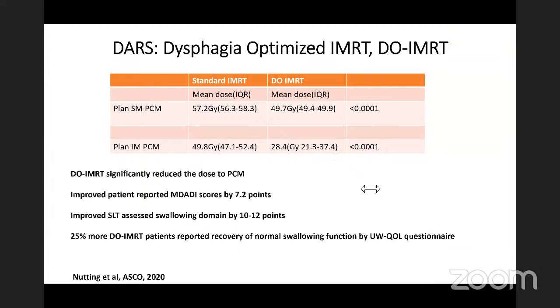One last question: what about the movement of the larynx during treatment? What should be done to overcome it? We tell the patient, when the larynx is getting treated, not to swallow during the treatment. And that's why VMAT becomes important, as the treatment time is shorter. It becomes very important, especially when you're doing early stage laryngeal cancer. Some people do carotid sparing IMRT for early stage laryngeal cancer, and I have seen patients failing in the anterior commissure, because in that situation you have to use the auto flash module for sure. And also you have to instruct the patient not to swallow during the treatment.